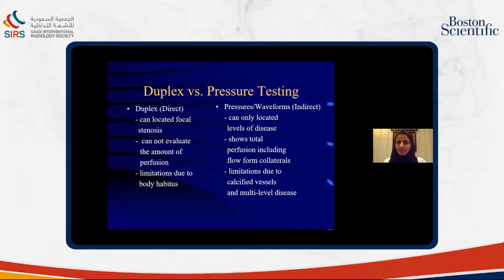The difference between duplex and pressure testing: duplex is direct to the vessels and can locate focal stenosis. For pressure, it can only locate the level of the disease.